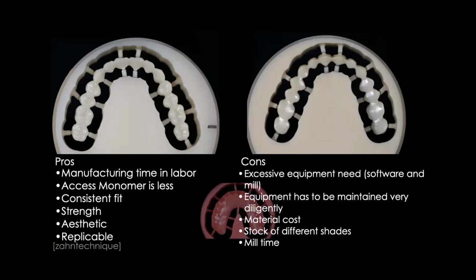So the pros, what was already mentioned a little bit, are the manufacture time and labor. It's definitely much better than analog dentistry. If we do setting up teeth and go the whole process, the excess monomer is less. The consistent fit is amazing. The strength and aesthetics are replicable like the printed ones.